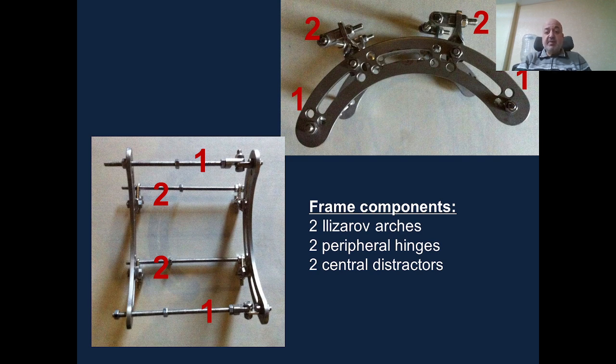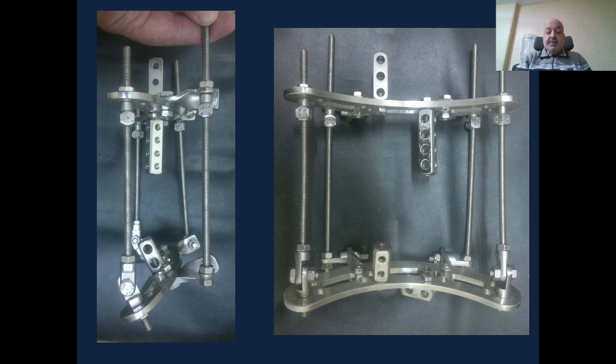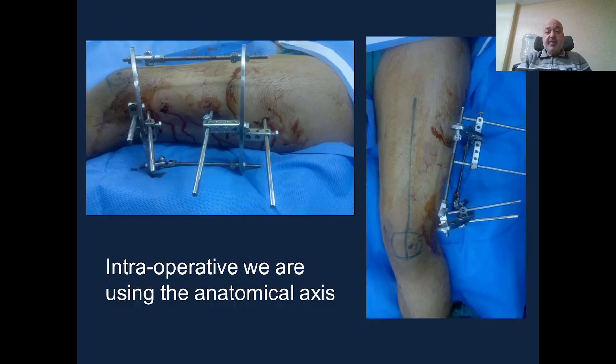It is a simple frame formed of two Ilizarov arches, two Ilizarov hinges attached peripherally in location number 1, and two central distractors in location number 2. This is the frame, completed.